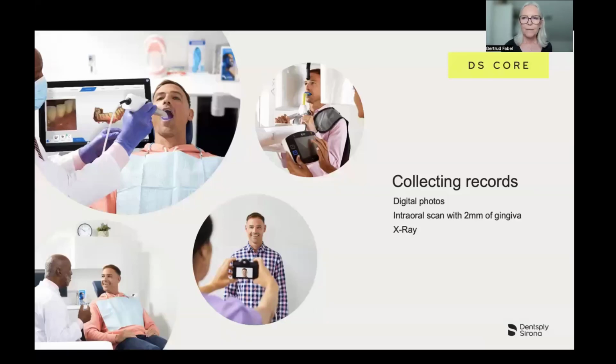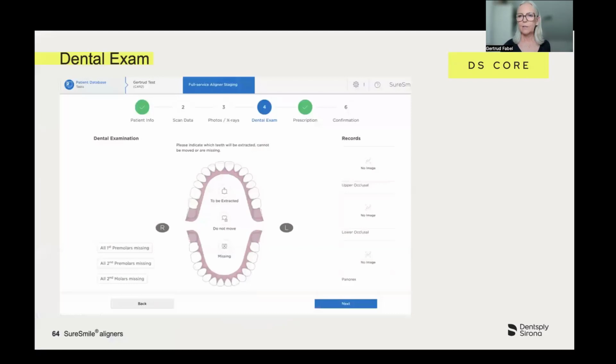I think you recognized Annika. And how does it work in detail? I make digital pictures, actually not myself, it's all my assistants' work. And also the intraoral scan: I give advice to scan 2 more millimeters of gingiva to have very well-fitting aligners in case I choose the straight trim line. I always recommend to scan the upper gum to see the midline while they do X-rays. And this is all we need.